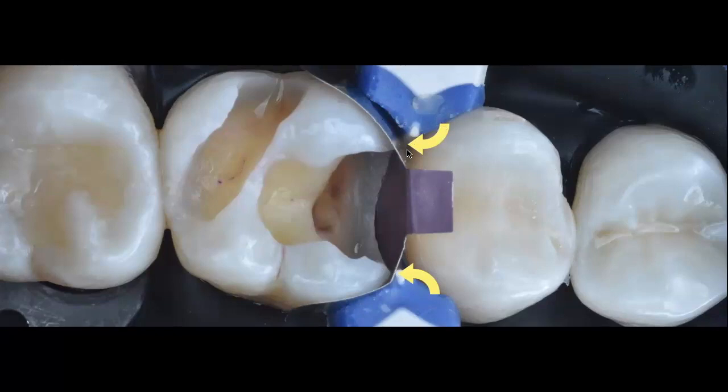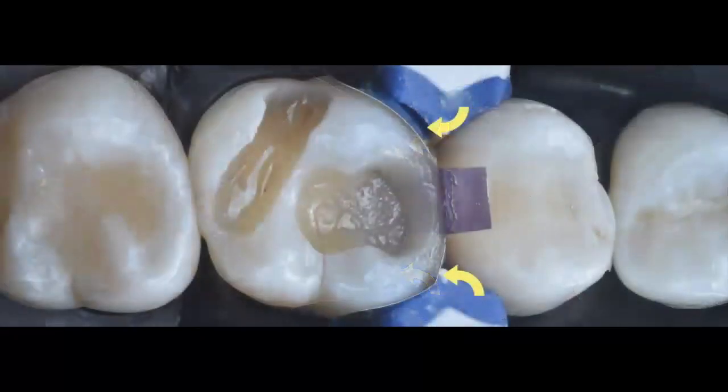where I'm sure that I'm going to be able to reestablish a nice and wide contact between these teeth, but at the same time keep the natural buccal and lingual embrasures, which was really what I wanted to try to solve for this patient, because this excessively wide buccal embrasure was allowing food impaction and gingival irritation. So now you can see that I've been able to restore the proximal wall of tooth number 14.